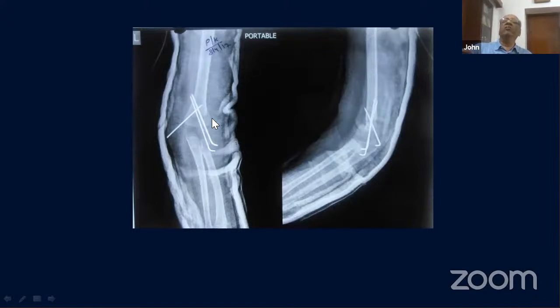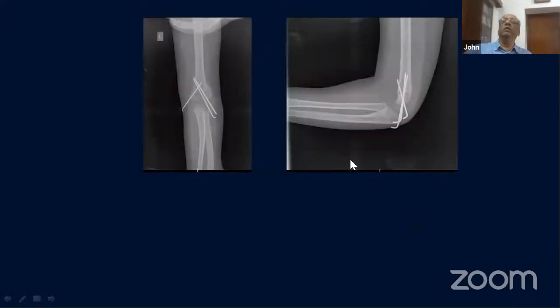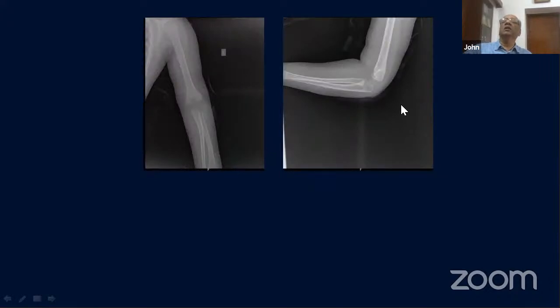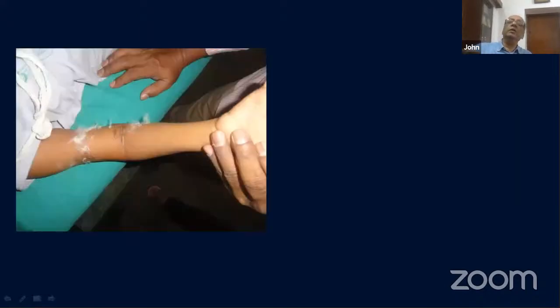In a very unstable situation you would use two lateral pins and maybe add a medial pin, but getting the reduction right on both AP and lateral views is critical. Follow-up imaging should show the fracture nicely reduced on AP and lateral with wires crossed proximal to the fracture and position maintained.